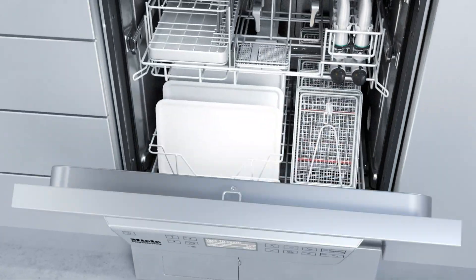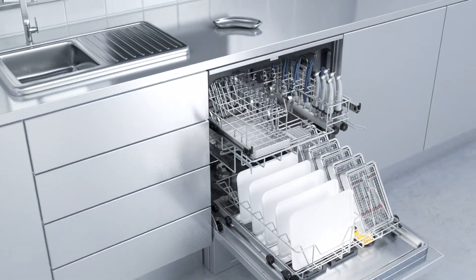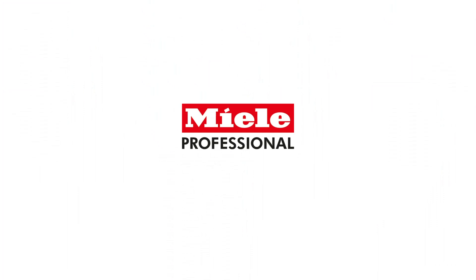High performance and efficiency. New washer disinfectors from Miele.